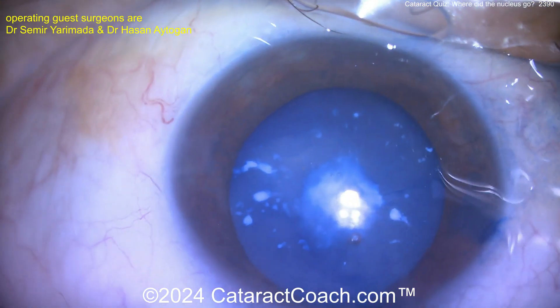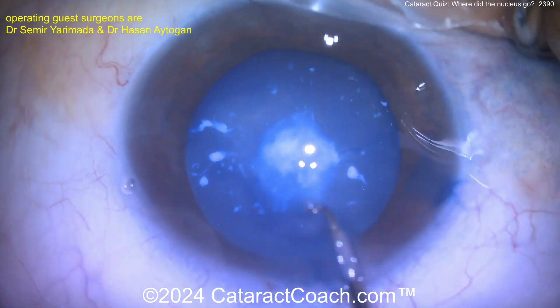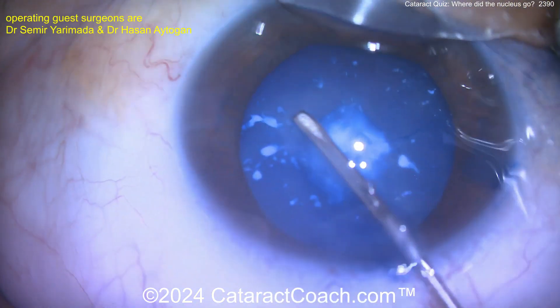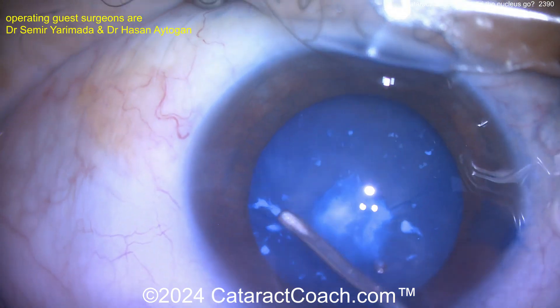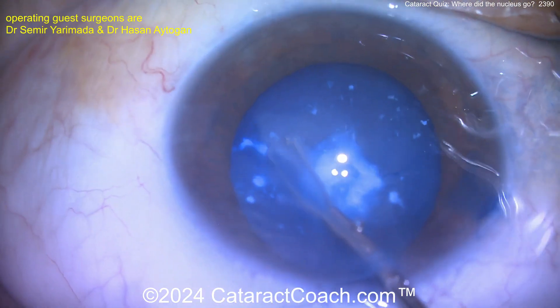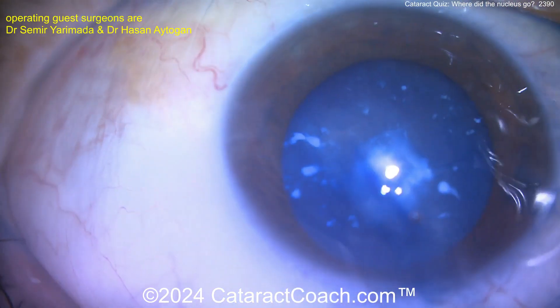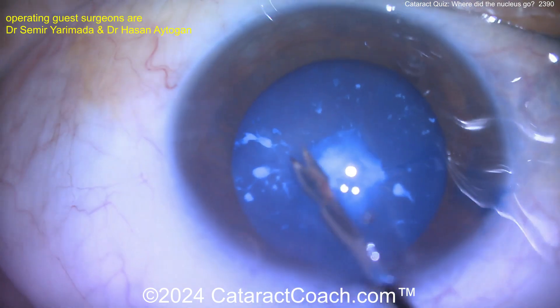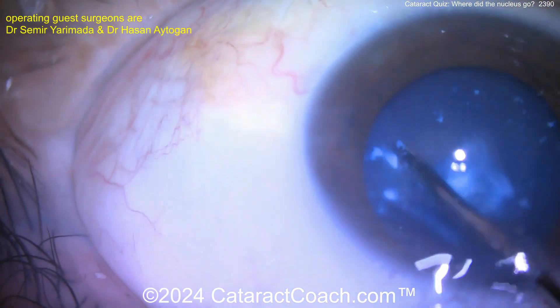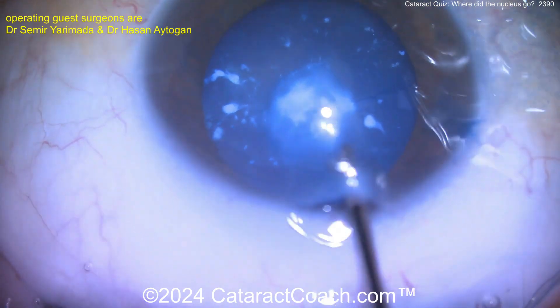With that much laxity of the anterior lens capsule, you probably have tremendous zonulopathy. Going in again with this sharp cystotome — look how difficult it is to get into the lens capsule. So maybe it's fibrotic. Now trying to get micro scissors in to try to cut into it. Again, a very unusual case.